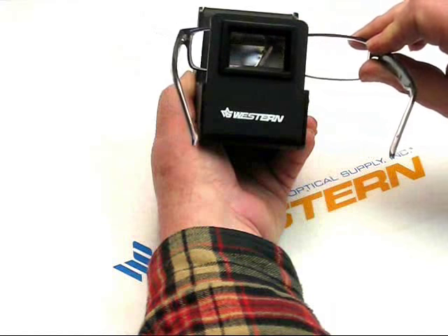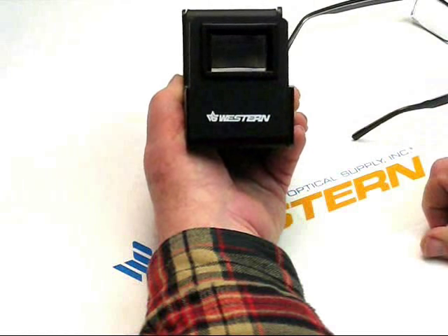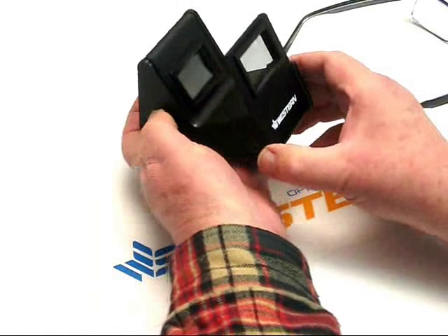As in an office building, going from inside the office building to outside in the wintertime. You can also use this to check for polarized lenses, to check the axis of the polarization. So that's the Western Optical Polariscope.